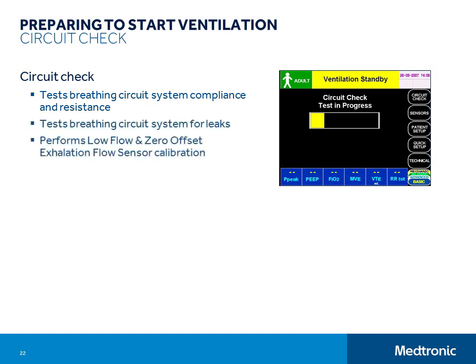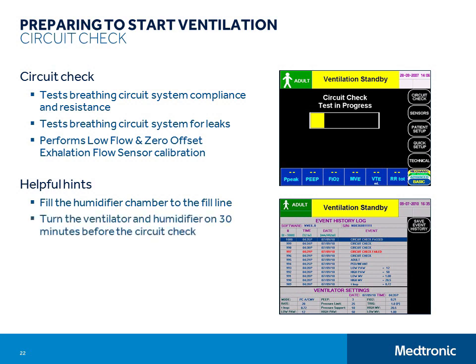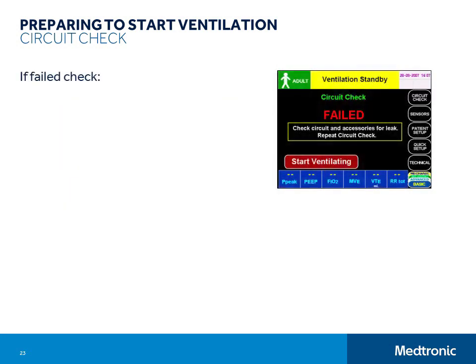The pass or fail result of the circuit check is logged in the event history. Always remember that you will get the best results from the circuit check — meaning that the measurements and calibration values will be most accurate — if you fill the humidifier chamber to the fill line, turn the ventilator and humidifier on about 30 minutes before the check, and keep the tubing very still during the circuit check. If the circuit check fails, you should check that the compressed air gas source is connected and functioning properly and that all circuit connections are really tight. Check filters for cracks and check circuit tubing for pinholes. Be sure to check that the water traps in your circuit system are tight and that none of them are leaking. Then repeat the circuit check.